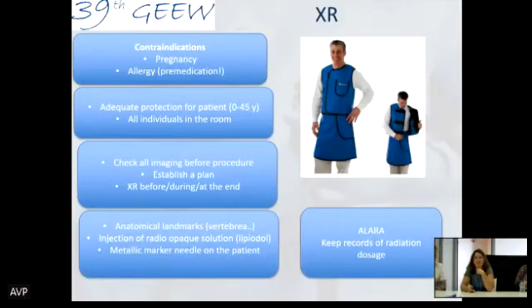So X-ray is also very important. We are very lucky to have technicians already working with us who take care of all this. If we have to do an ERCP in a patient that's pregnant, we will do it, but we'll be very careful to go to ALARA, as low as reasonably achievable. We are also careful about allergy and contrast. We can do an ERCP if the patient has an allergy to contrast, but you cannot do a percutaneous procedure because you might inject the blood vessels.